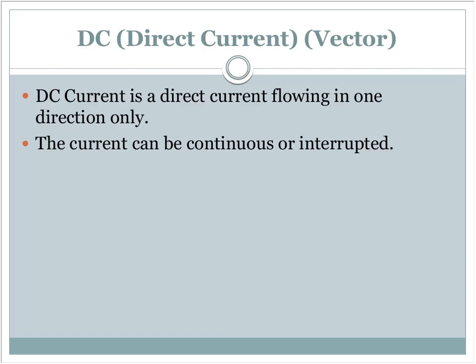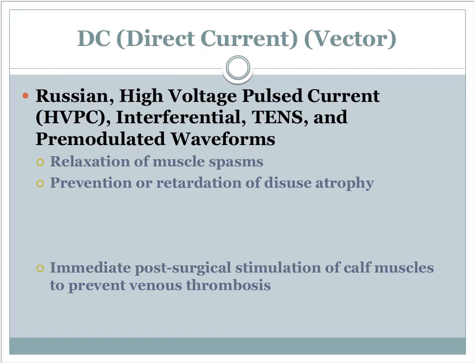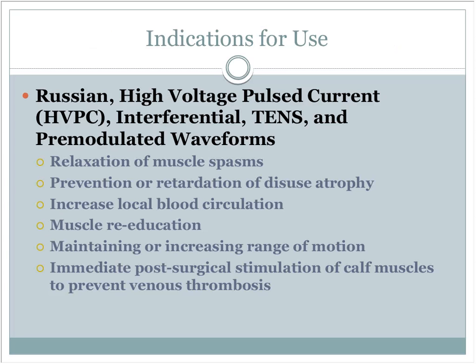Now, that's all the electrical current type things that we have to talk about in here right now, but just a general point with all of them. My personal feeling, again, is that I will never put a waveform or current or any type of electrical modality on a patient that I have not first put on myself. I want to know what it's going to feel like so I can describe that to the patient. If they're describing something totally out of the ordinary for my experience with it, I'm going to stop doing it and figure out what's going on with that.